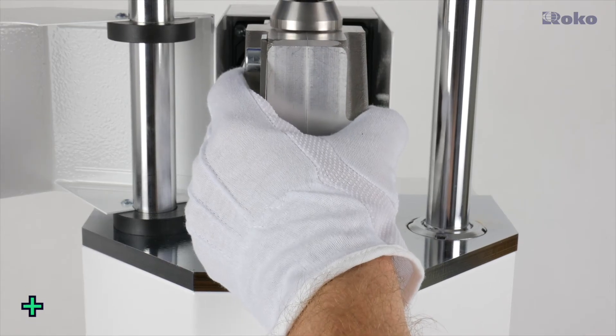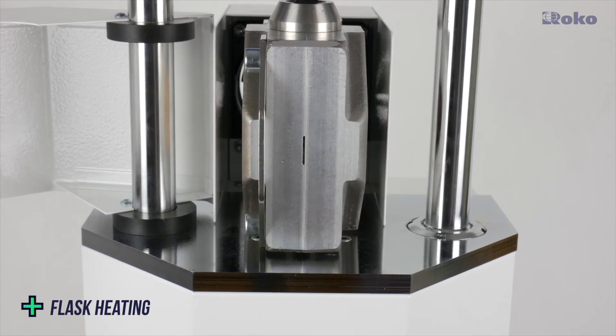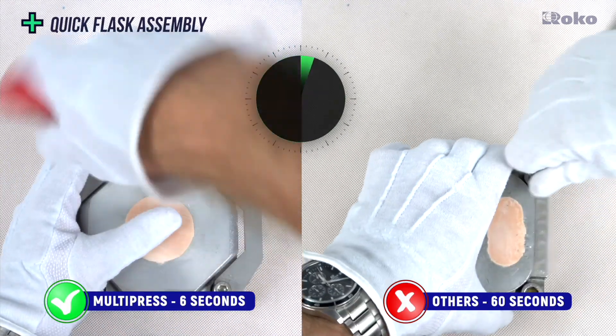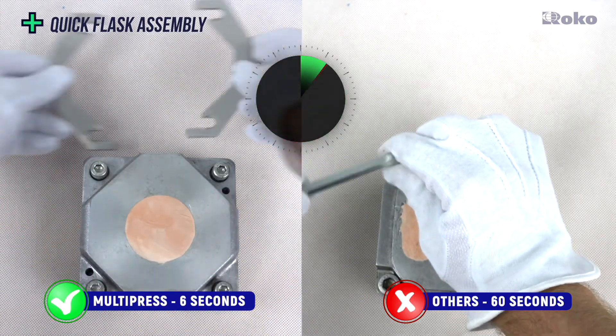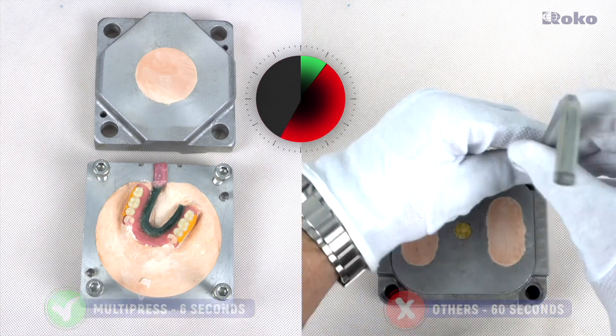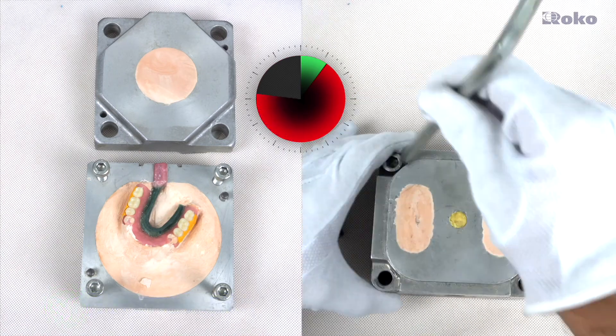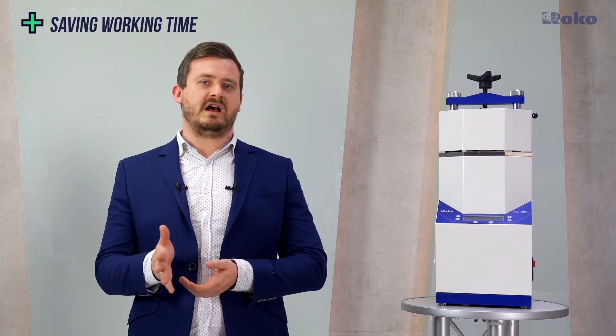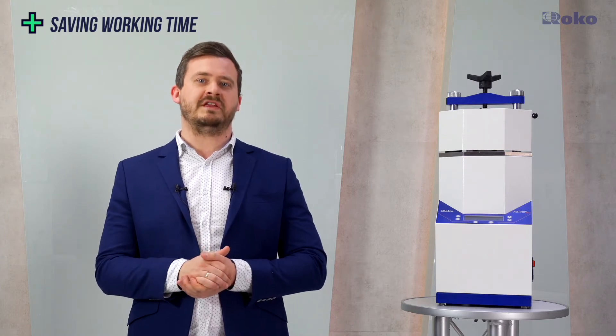During the entire melting process, the flask is heated and maintained at the appropriate temperature until injection. The flask in the Multipress system is fixed with clamps, so you don't have to waste time removing screws. The difference in assembly is over a minute, and time is important because the mold cools down with every second. This operation is repeated four times, so you gain almost five minutes per denture in the Multipress system, saving you hours of work per month. This is a measurable profit.